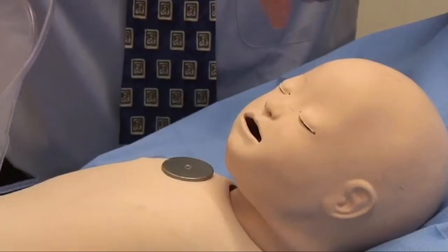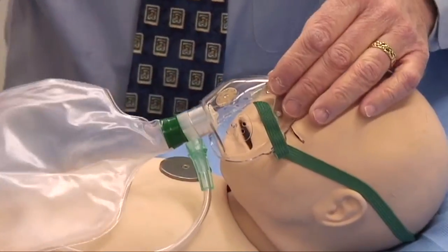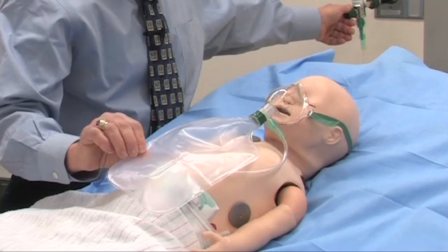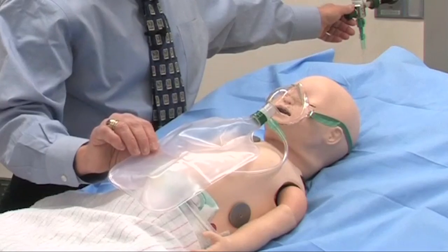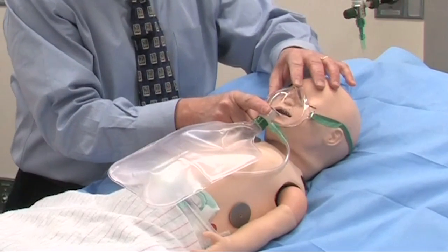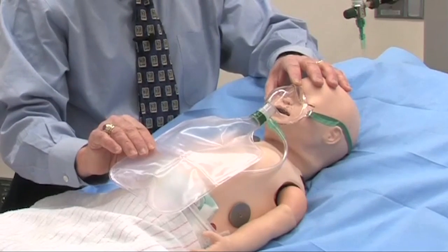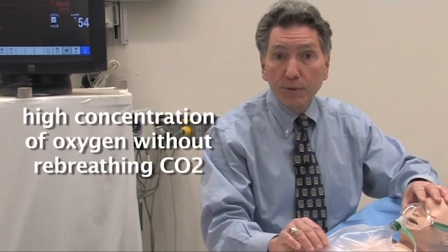The process of putting this on the baby is relatively simple, although a little difficult to demonstrate on the mannequin — you get a good tight seal. Set your oxygen flow enough that the bag fills up and never completely deflates during the baby's breathing cycle. As long as you've done that, got the tightest seal you can, and you can see the bag going up and down, the mask is set up to deliver a high concentration of oxygen without the risk of the baby re-breathing CO2.